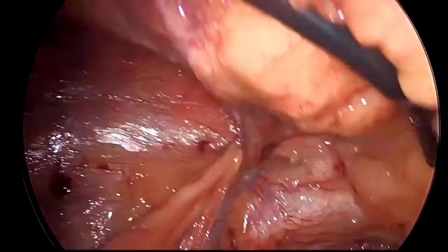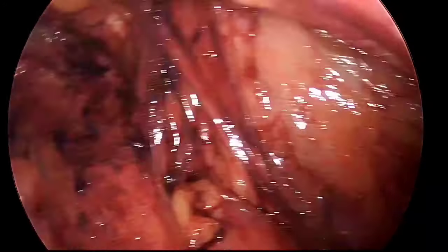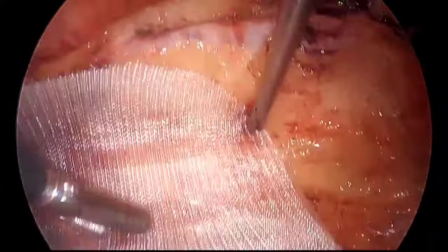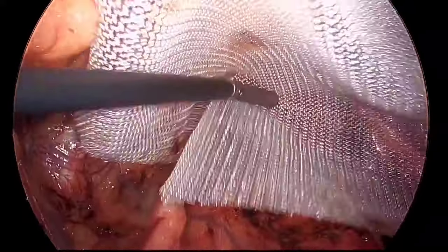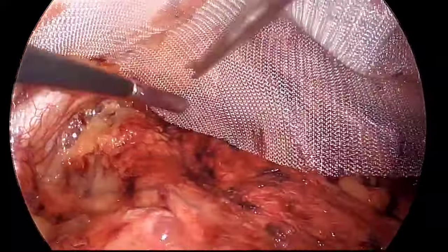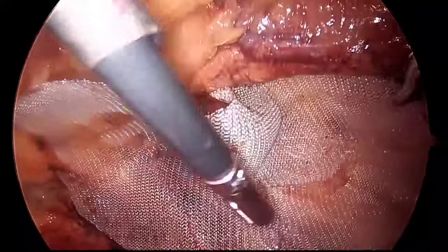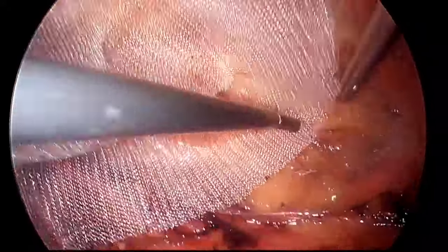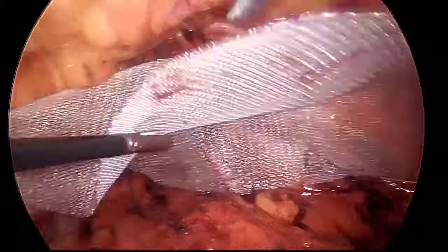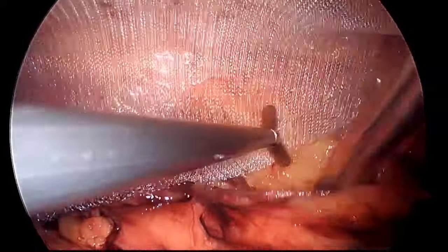Now this is the left indirect hernia, direct hernia, and right sided large recurrent indirect inguinoscrotal hernia. So three hernia defects were there. One was repaired. Other defects on the left side were small, so we left as it is. So now on the right side I have placed a 12 by 18 centimeter medium weight polypropylene mesh, as I have created enough space to place a big mesh. After placing the mesh, I have unfolded the mesh. It will sit nicely over that area, covering all the potential hernia sites.